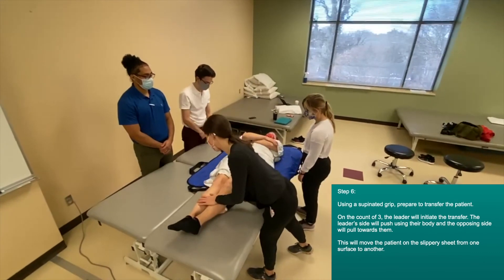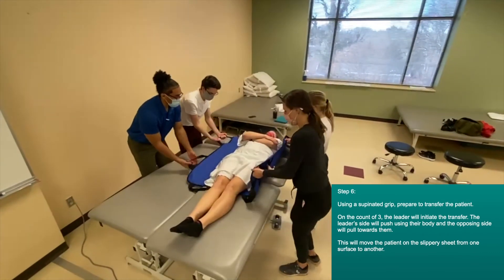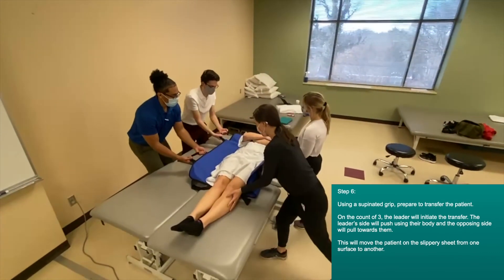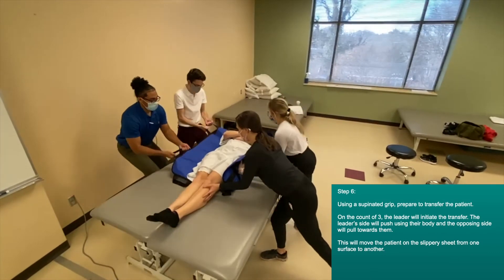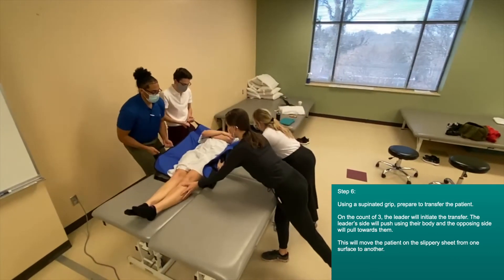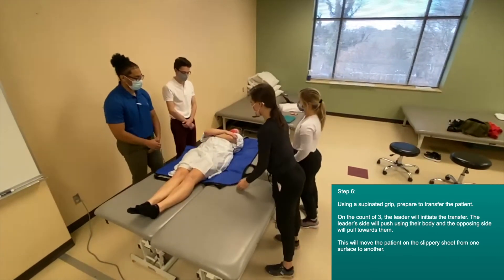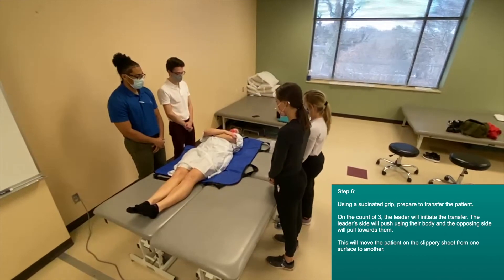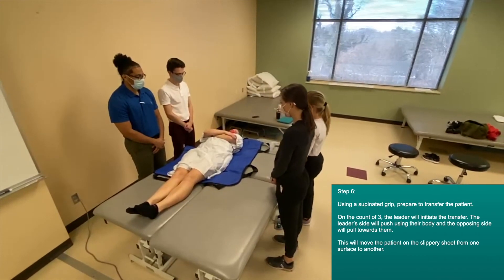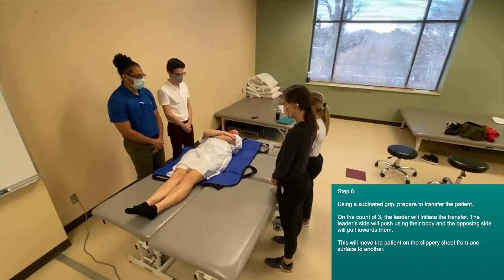Using a supinated grip, prepare to transfer the patient. On the count of three, the leader will initiate the transfer. The leader side will push using their body and the opposing side will pull towards them. This will move the patient on the slippery sheet from one surface to another.